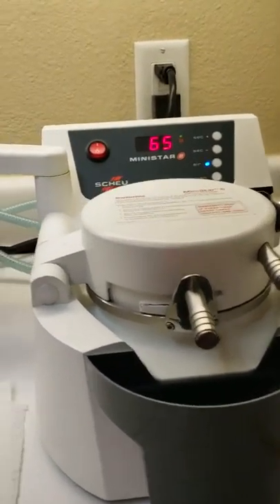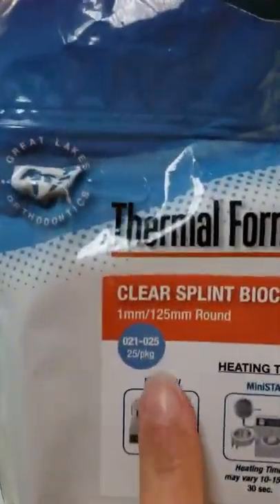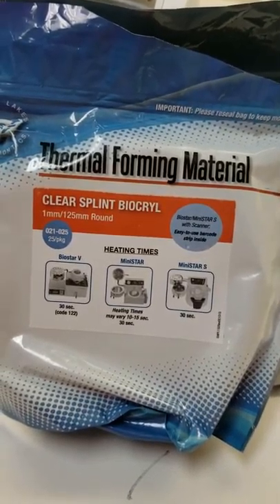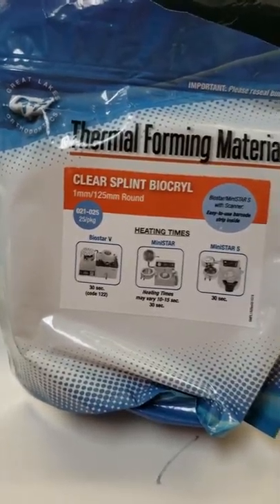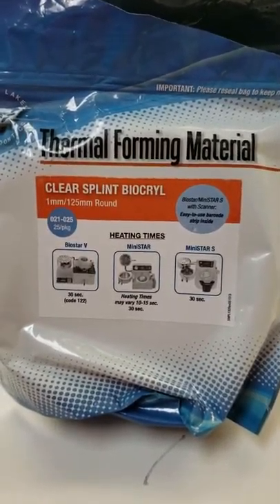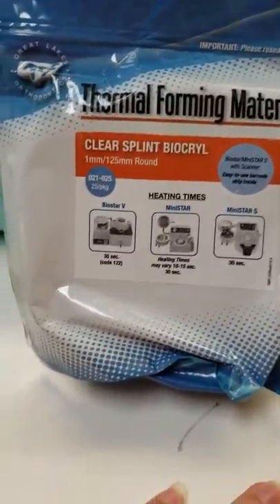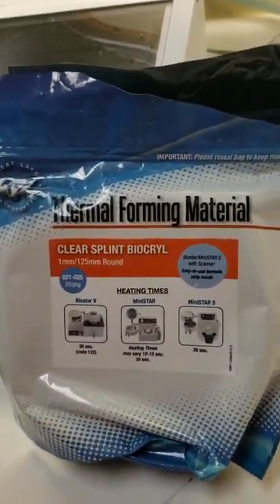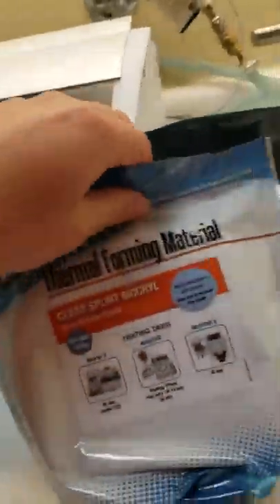As for tray thickness options: we have a one-millimeter material that I don't use as often. It's really used for a surgical stent or a temporary — it's pretty thin and flimsy. Sometimes we'll use it as a temporary retainer for someone who has a temporary crown and an implant situation but went through Invisalign and doesn't want anything to shift around. That's a good time to use the one-millimeter thickness.